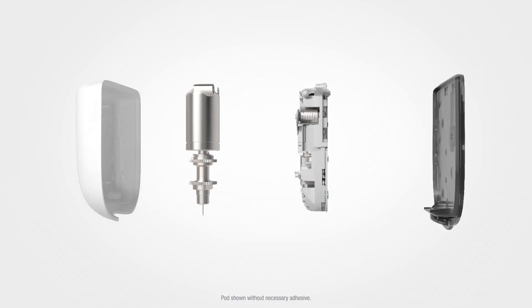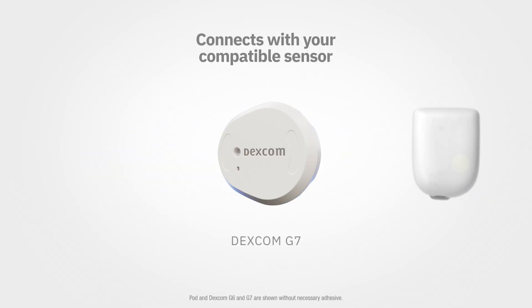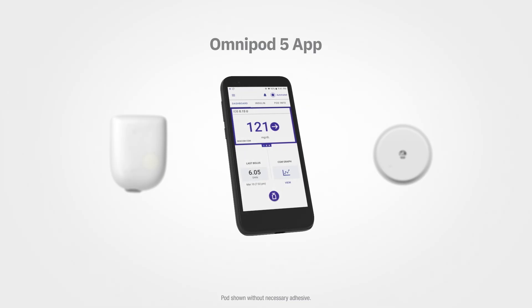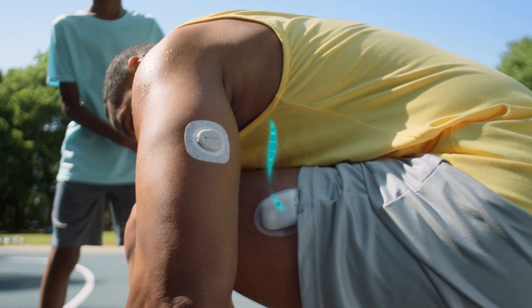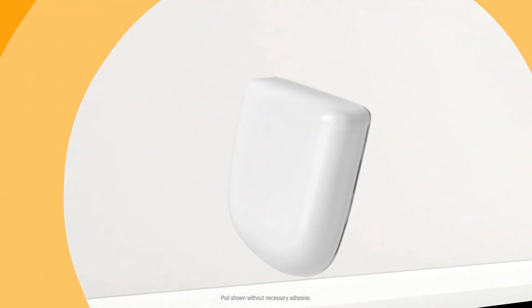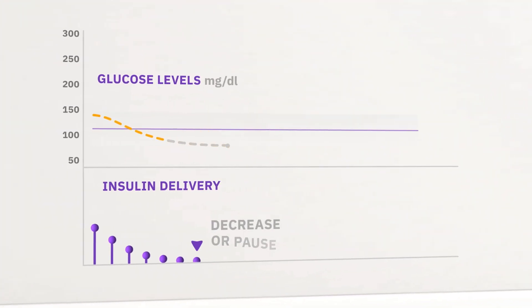The Omnipod 5 tube-free pod connects with your compatible sensor and the Omnipod 5 app with Smart Bolus Calculator. Every five minutes your sensor reports glucose levels to the pod. Smart Adjust technology within the pod automatically adjusts your insulin.